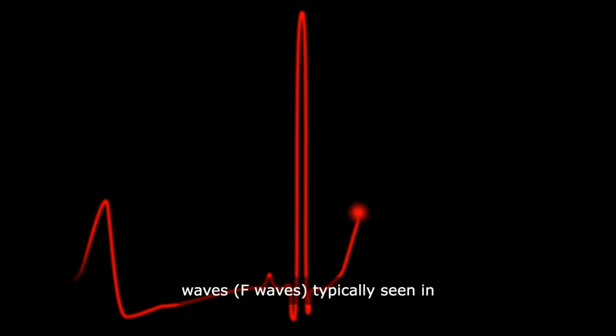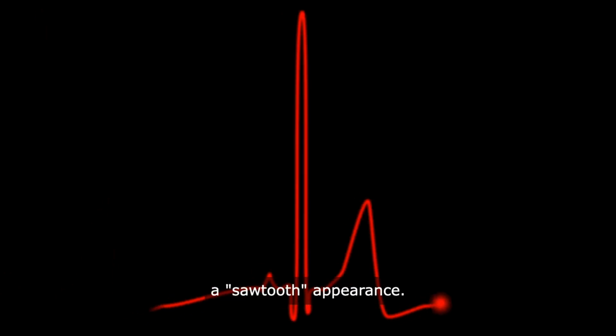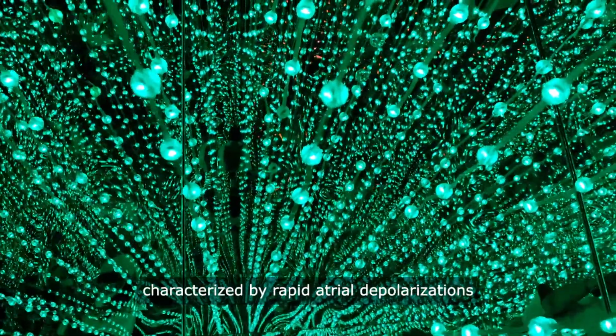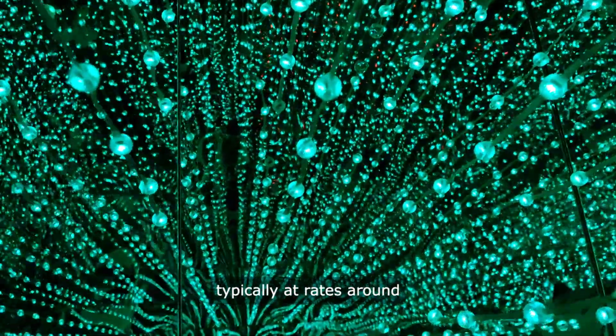Atrial flutter. ECG changes: sawtooth-shaped flutter waves, F waves, typically seen in leads 2, 3, and AVF, with a sawtooth appearance. Explanation. Atrial flutter is characterized by rapid atrial depolarizations, typically at rates around 250 to 350 beats per minute, leading to a regular and fast ventricular response.